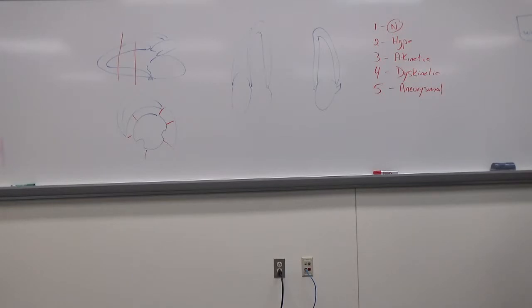Okay? So very plausibly I can ask and will ask most definitely, I will give you a wall segment or a couple of wall segments and ask you which coronary artery is likely involved. Okay? That is the essence of what we're doing in stress echo. So in conjunction with an echocardiogram during a stress test, what else are we doing? EKG. We are definitely doing an EKG. So the EKG stress test is going on at the same time we do the stress echo.